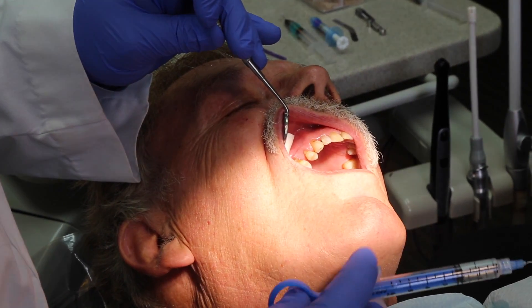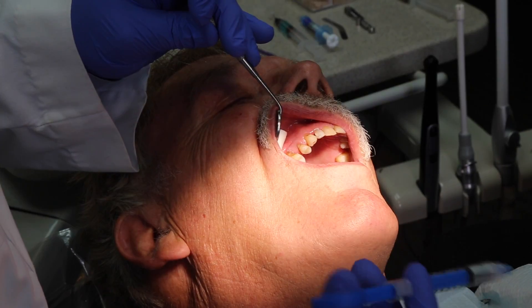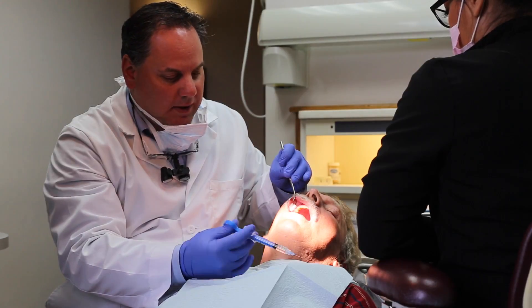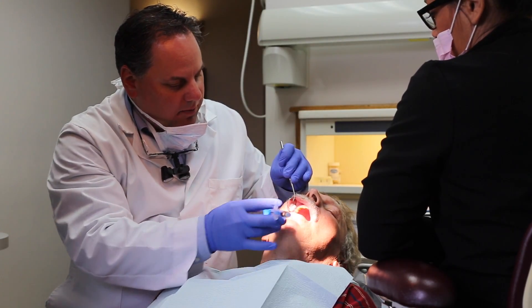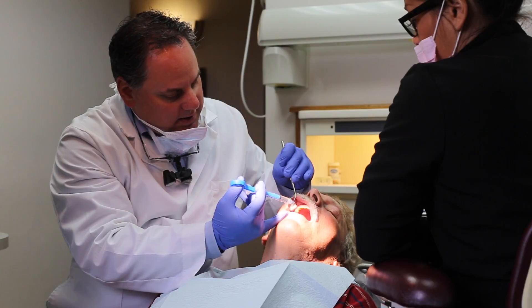We just let that soak for about seven to ten seconds. This anesthetic is so amazing and efficient that I allow it to work for maybe about 20 seconds. What it's doing right now is soaking through the tissue, allowing us to make a profound anesthetic injection without the patient actually feeling it. For the most part we know that this area of the mouth can be very sensitive, but with this medicine it's not too bad at all.